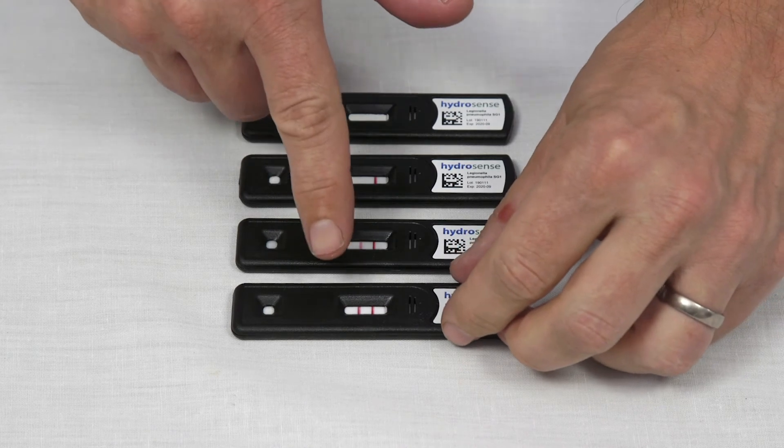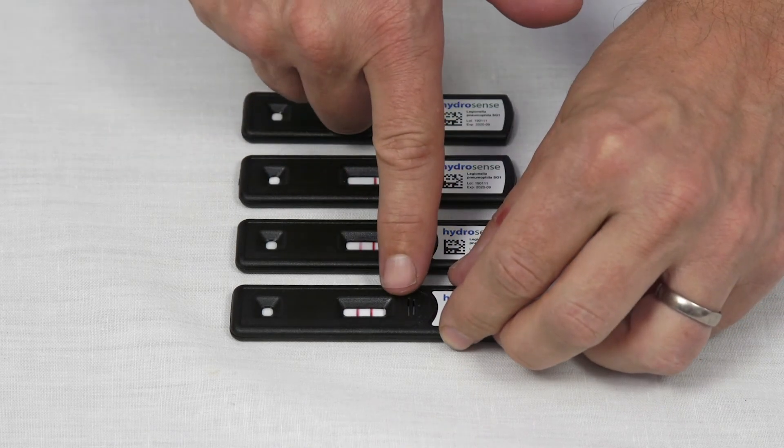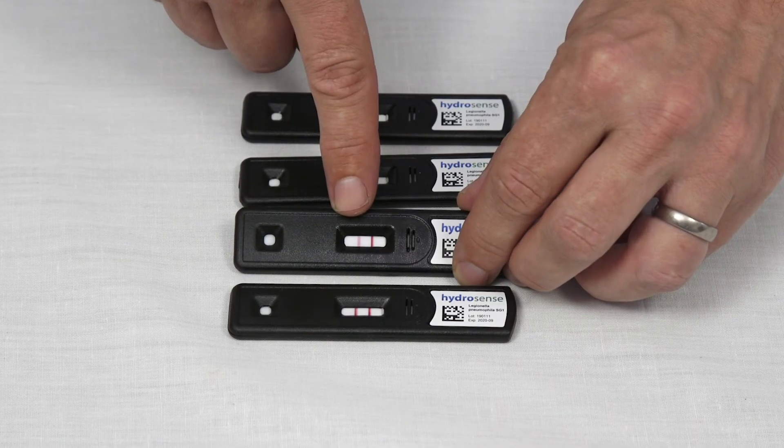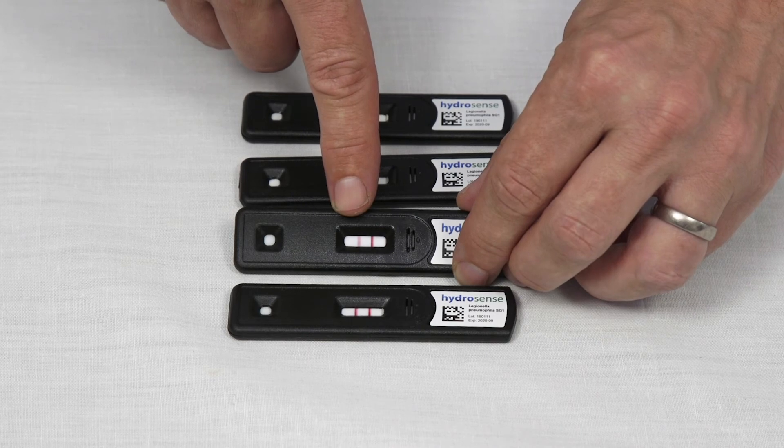The test is composed of two lines: a test line and a control line. If both lines are present, then Legionella pneumophila serogroup 1 has been detected above the cutoff of the test kit. The positive signal at the test line may be weak, but any line at this position indicates a positive.